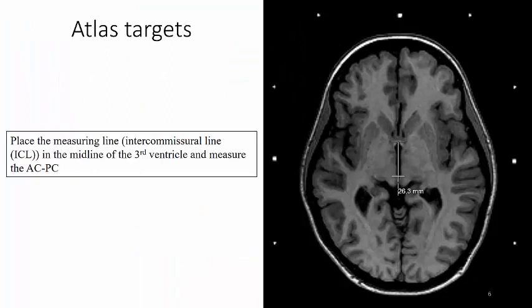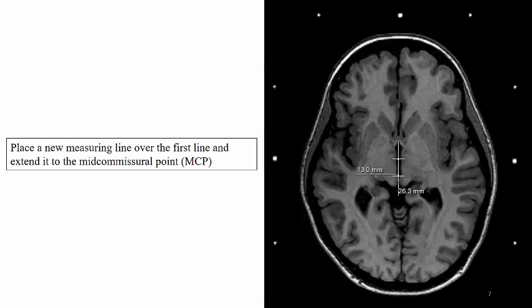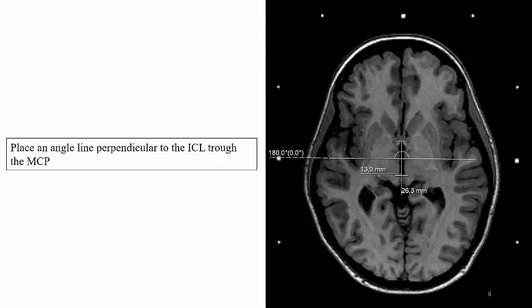When we are performing atlas targeting, then we start by placing a measuring line from the AC to the PC. We place a new measuring line over the first line and extend it to the mid commissural point. We place an angle line perpendicular to the ICL through the MCP.